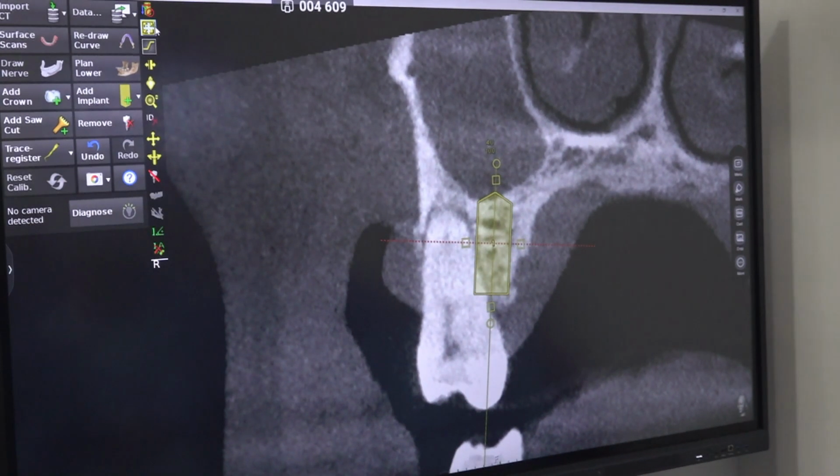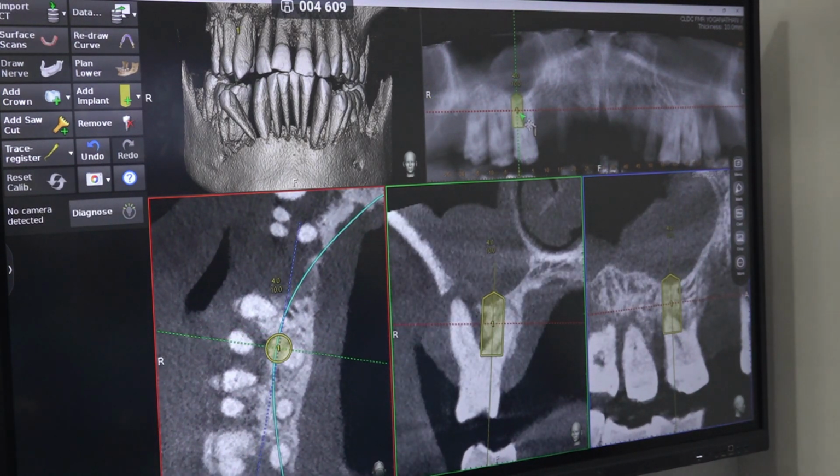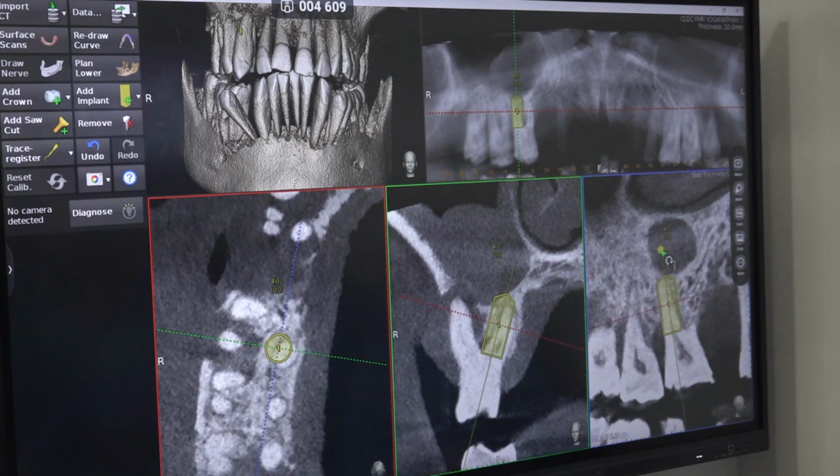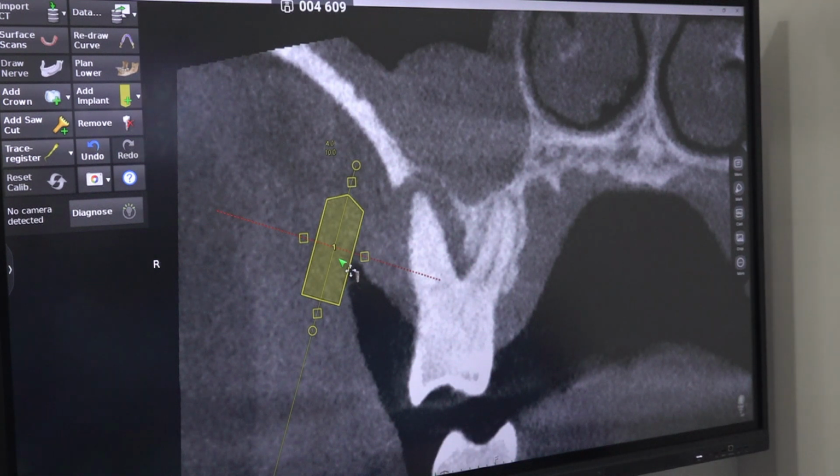So now we are slowly going towards the palatal socket. The palatal socket is one of the areas where, if you use it properly, you can avoid pterygoid. That is how we avoid pterygoid for many cases. See the palatal socket.